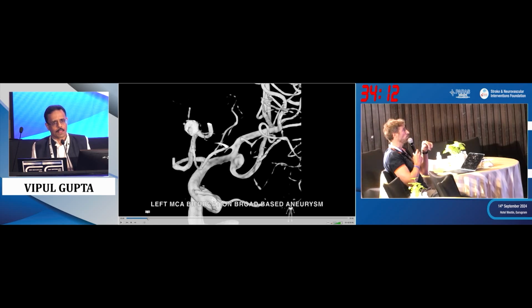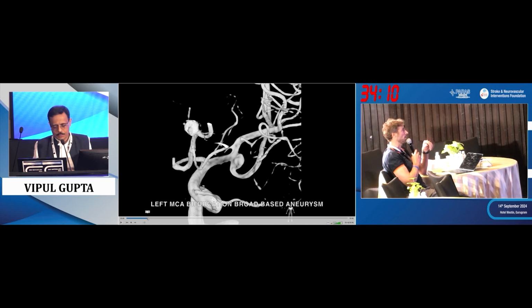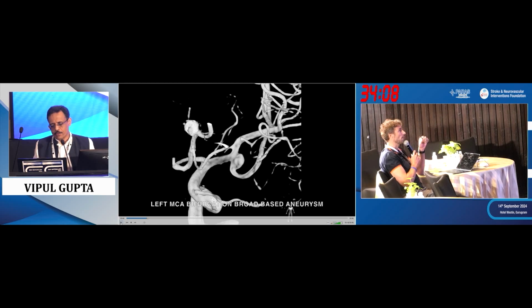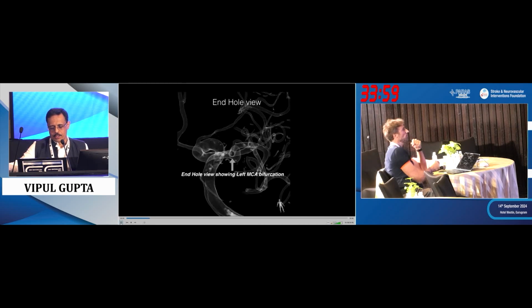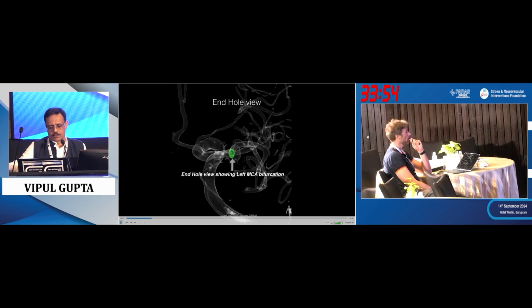It's very easy to do. All right, that's not a difficult aneurysm in my view with one stent and coil. I don't think so. All right. And here you can see this is the down the barrel view as we like to create, and we were discussing in the slides course as well.